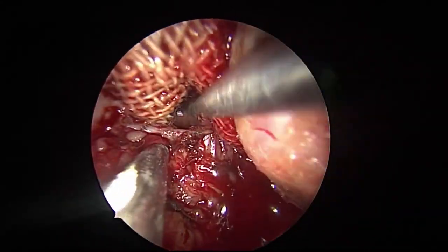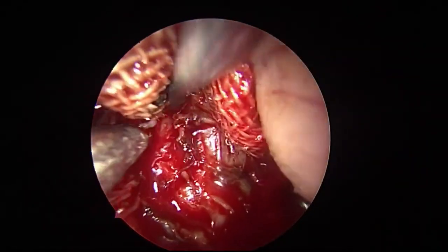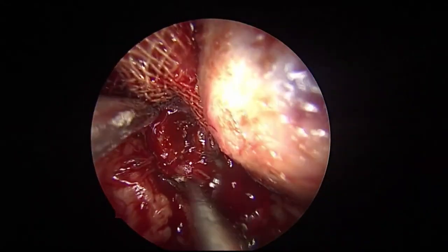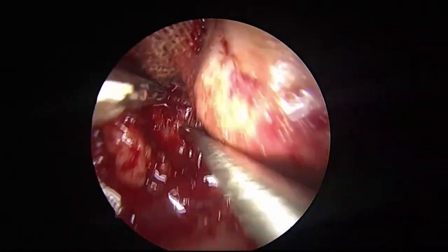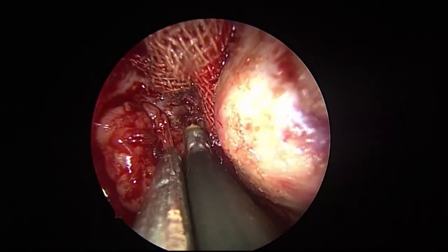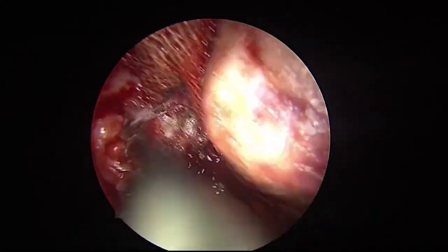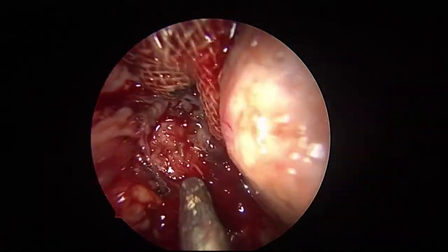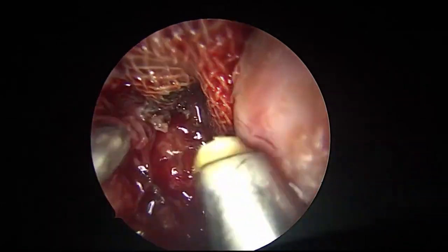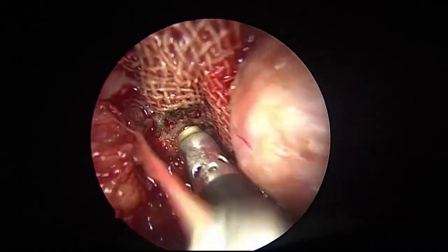Some more periosteum, I will cut this. Coblator. Periosteum, cutting this. In between, I use the cutting mode to cut anything.